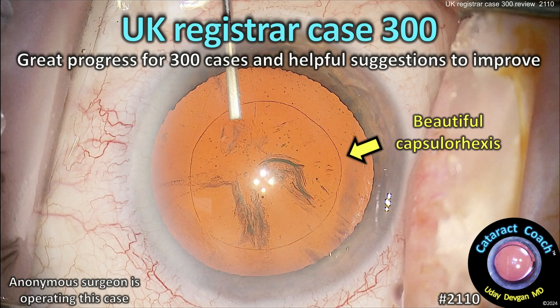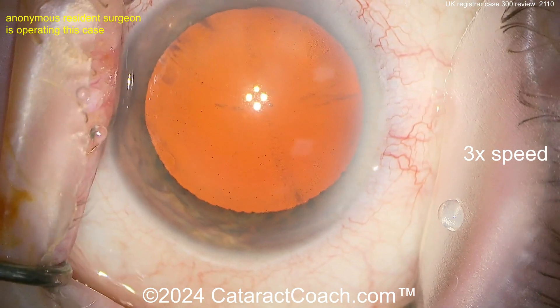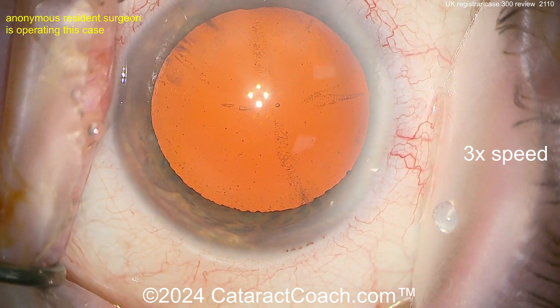Cataractcoach.com — UK registrar case number 300. Great progress for 300 cases, and let's give some helpful suggestions for more improvement. A registrar is what a resident is in the U.S. or other parts of the world — a young doctor in training.